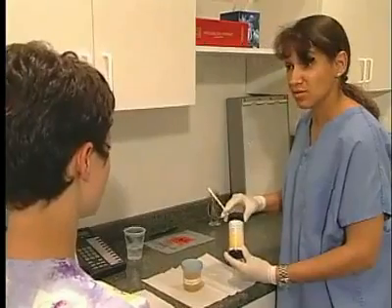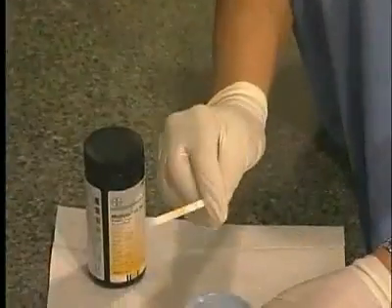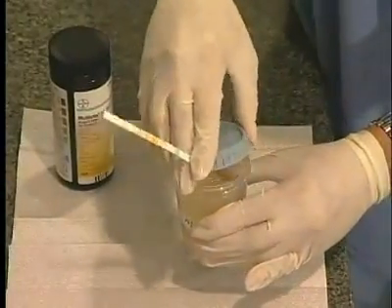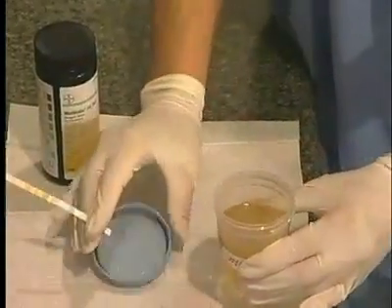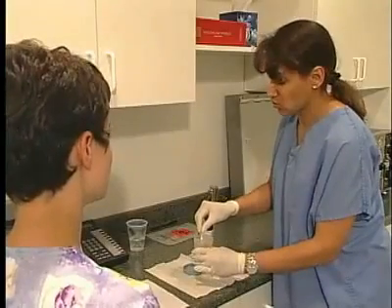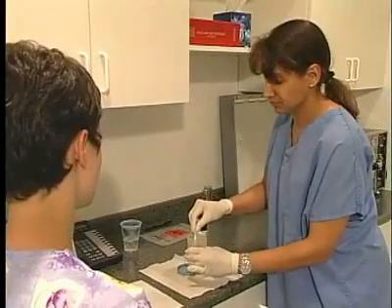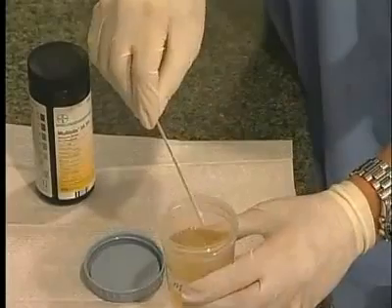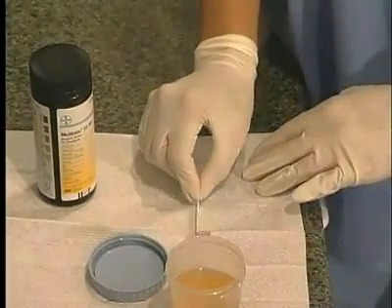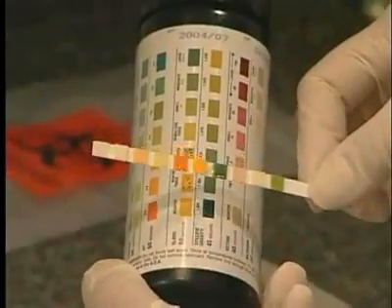This plastic strip contains chemicals impregnated on it that will change color when dipped in urine. You can compare the color changes to the ones on the strip's container to determine whether or not you have a normal value. Reagent strip tests are available for pH, protein, glucose, ketones, blood, bilirubin, nitrite, leukocytes, specific gravity, and others.